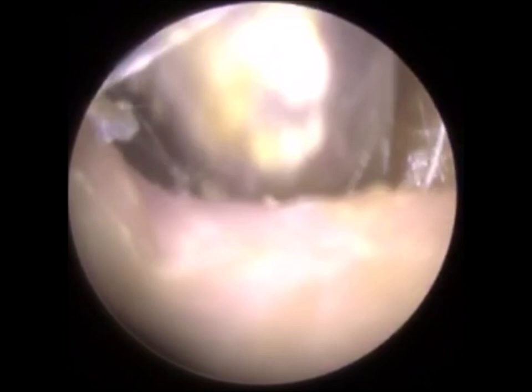Just trying to get a different angle there to see if it helps. So I've just gone to the base inferiorly, trying to lift this plug upwards. So remember, he's got that trench, that cave. So just trying to lift it upwards so the base of this plug can kind of be released. And I've just gone a bit deeper in with the suction probe, trying to get a bit of a suction grip on a bigger piece of the plug. And there we are. That's a big piece. I think there's still some more in there, believe it or not, yet.